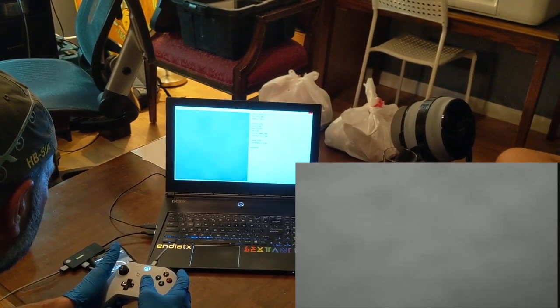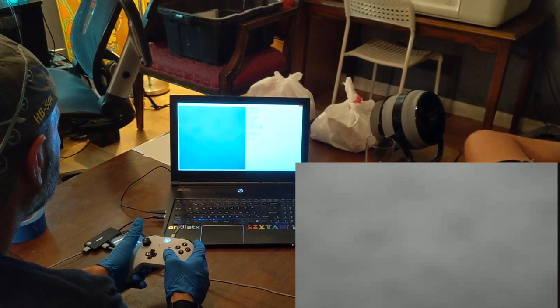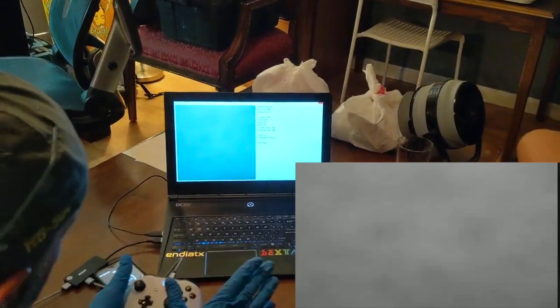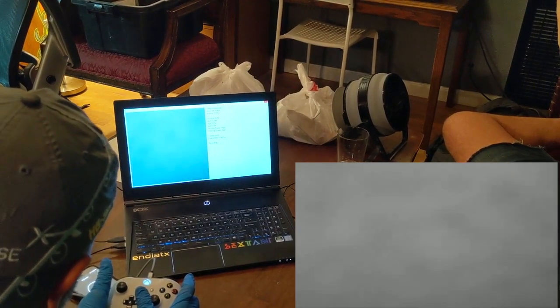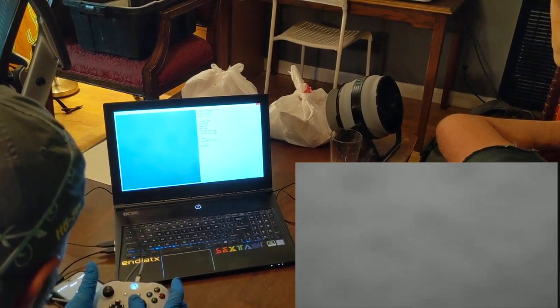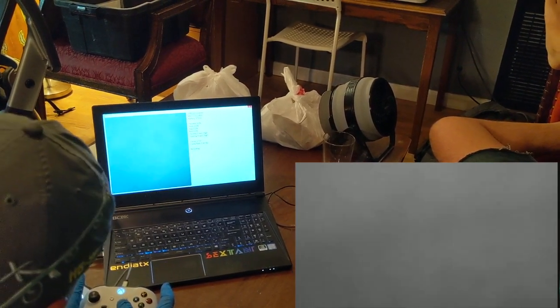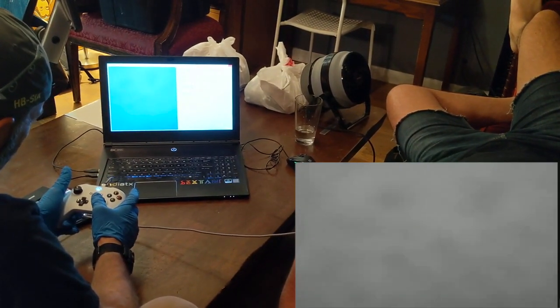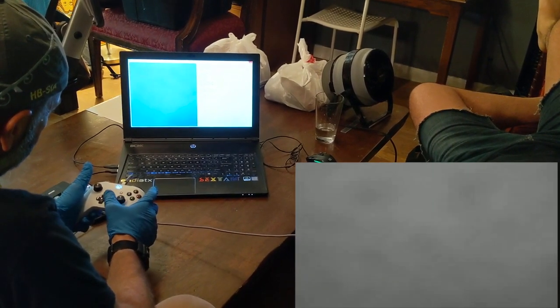It should be noted we were a little hazy with our view window for this bot. That's some good texture there. As we resolve those little issues, we're going to get a lot more. So I was kind of over to the right. Just a slight movement. I'm going to try and look at that — is that like your esophagus? I guess you'd have a lot of folds in the surface area. See that big black thing — a little more to the right.